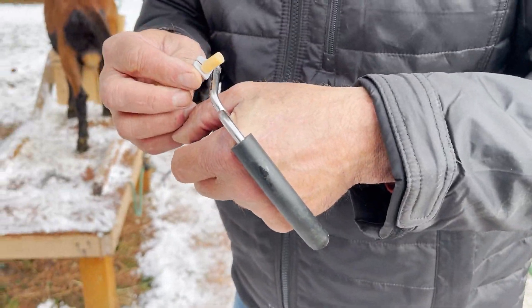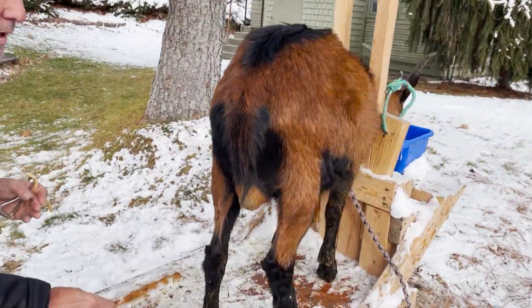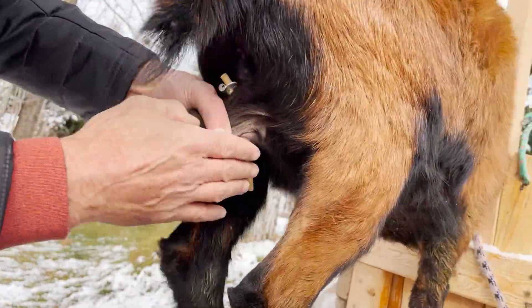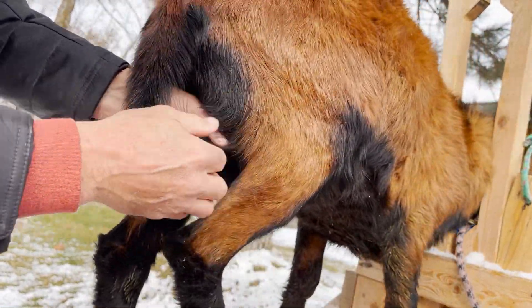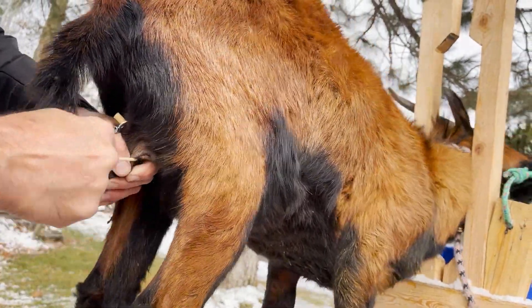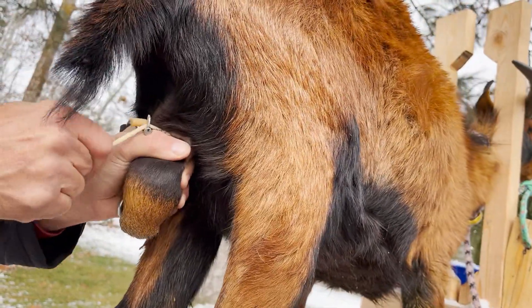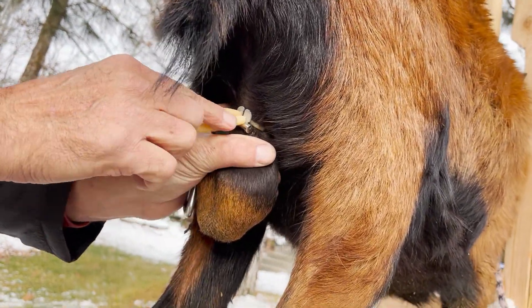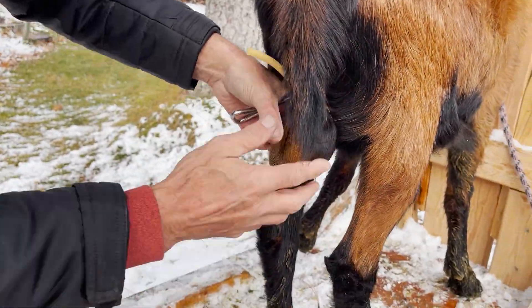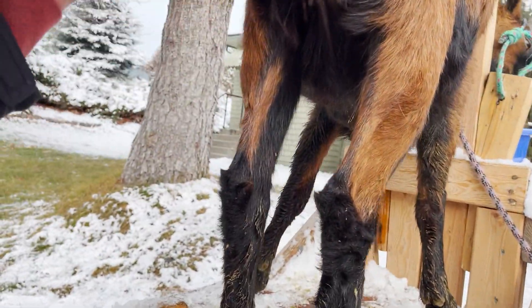Oliver's our last little guy. Go ahead and grab him. Get those pulled down to the bottom — see how I grab and get all I can out of it. It's under full tension now. There we go — perfect. See how that sits right in that little groove? Now it's perfect. Get that off, make sure the teats aren't in there — which they're not.